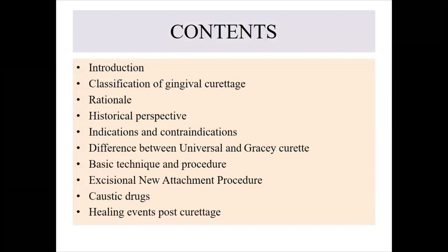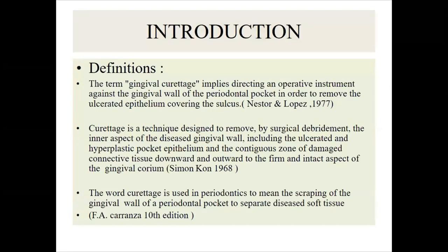Talking about the content of this lecture, it comprises the classification of gingival curettage, rationale, historical perspective, indications and contraindications, the difference between universal and Gracey curettes, basic technique and procedures, excisional new attachment procedures, caustic drugs, and healing events post curettage. So basically, talking about curettage.